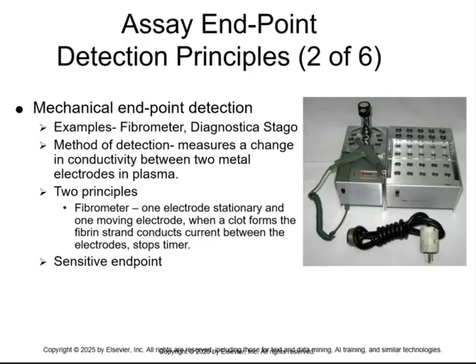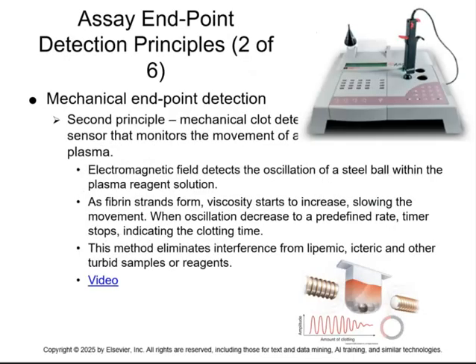So here with the fibrometer, it's got like one little wire, and it clicks, click, click, click, and then it clots and the click stops. That's because we've got a clot made. So that was like the first big-time way it could be done, actually testing.